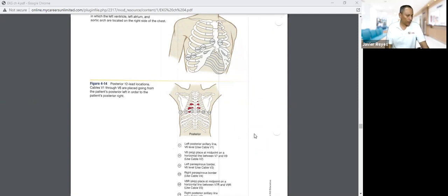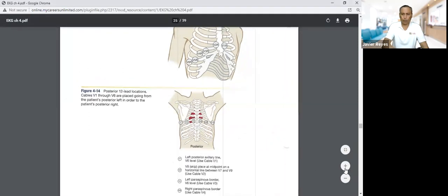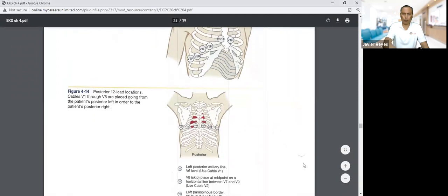Now, what if someone is in a contracted position or in a position where you cannot put the electrodes on the chest like you normally can? What do we do? Well, sometimes the doctors may order a posterior 12 lead EKG. A posterior 12 lead EKG. You look on figure 4.14, it tells you cables V1 through V6 are placed going from the patient's posterior left to the patient's posterior right. So it gives you the anatomical positions here of where the wires would go.